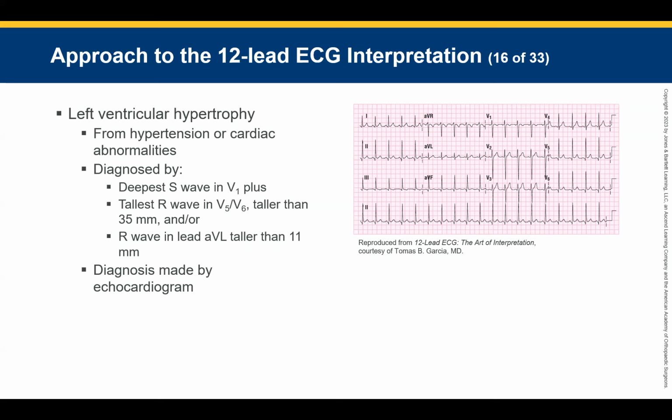There's a mnemonic for this that goes in order. You remember this: lateral, inferior, septal, anterior, lateral. Because it's hard to memorize this. And I'm going to say this a million times, and you're not going to like it. It doesn't matter. I'm going to make you say it, just like I made you call it the 300, 150. That was annoying. But everybody knows the 300, 150 model now? Okay. We're going to do this over and over.